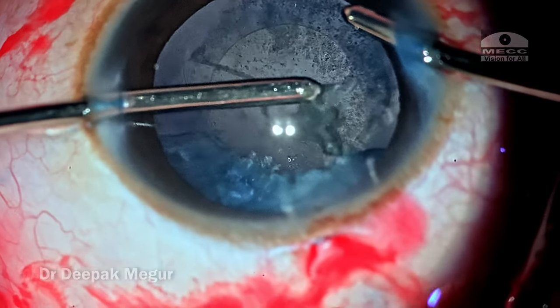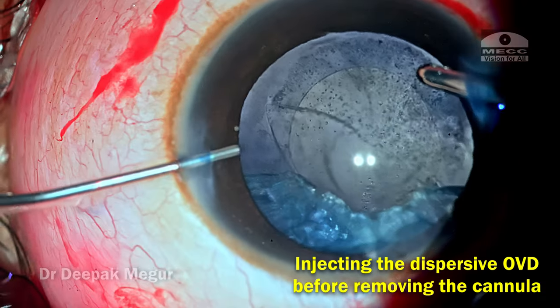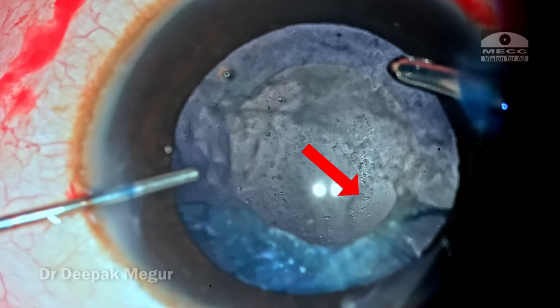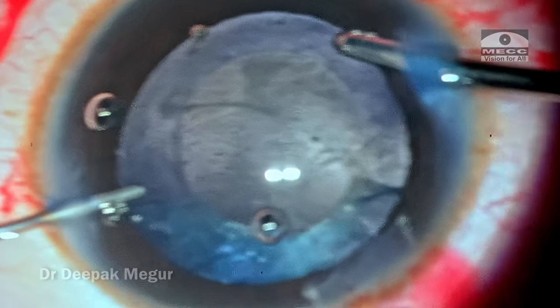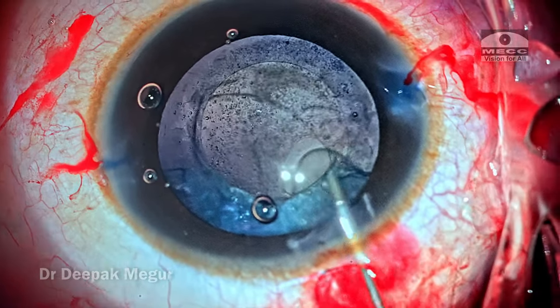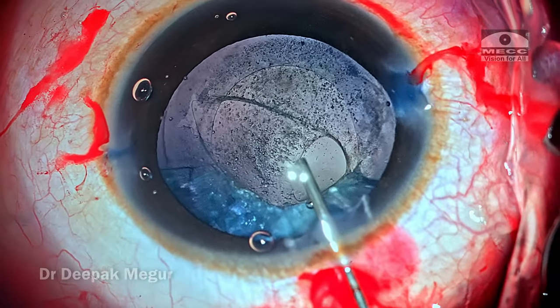Without removing the irrigation handpiece, I am injecting dispersive OVD from the side port. At this point I can clearly see a small ring appearing under the posterior capsular tear, suggesting this is the area where the anterior hyaloid is ruptured. As I push the OVD at this angle, the ruptured anterior hyaloid is very much visible.